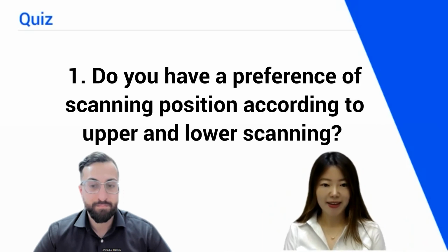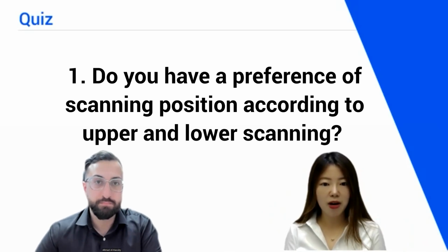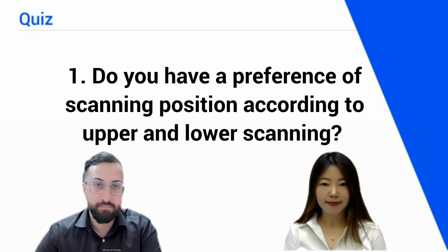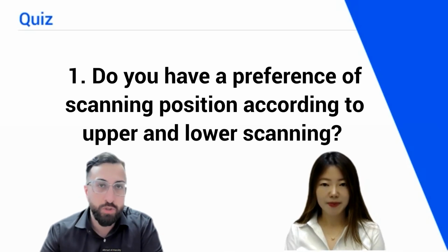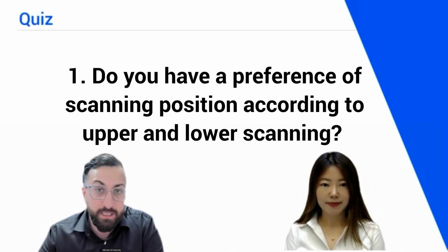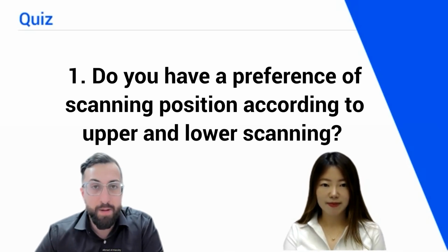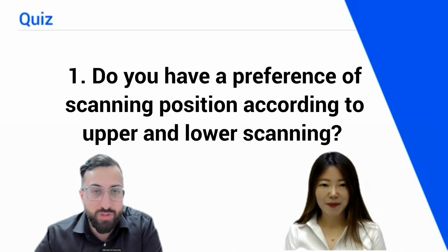Question number 1. Do you have any preference of scanning position when you are doing upper and lower arch scanning? That's a good question, and that really comes down to almost personal preference. So I actually stand when I do all my dentistry. I know that might be a little bit crazy, but it's something that I've kind of just gotten used to.